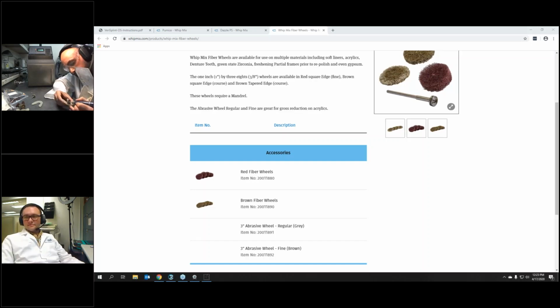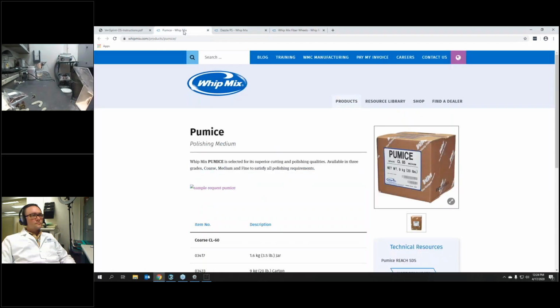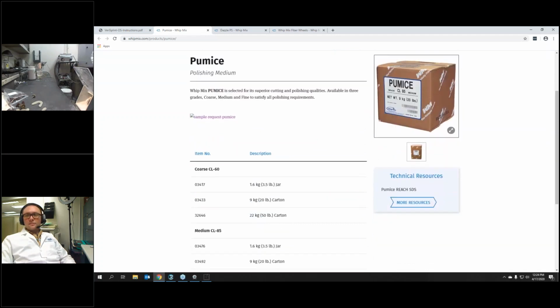Just about good to go. All right, any other questions on what he's doing now? All right. So I'm gonna go ahead and remove the Uvatron, and then I'm gonna set up my lathe. So I got a couple more minutes while I get everything set up. And what he's going to be using today on the lathe is going to be our pumice. You could also use the PS Dazzle pumice substitute, but what he's using today is just regular pumice.